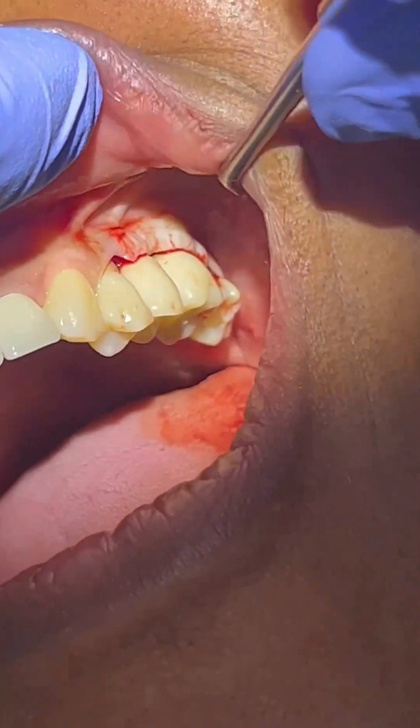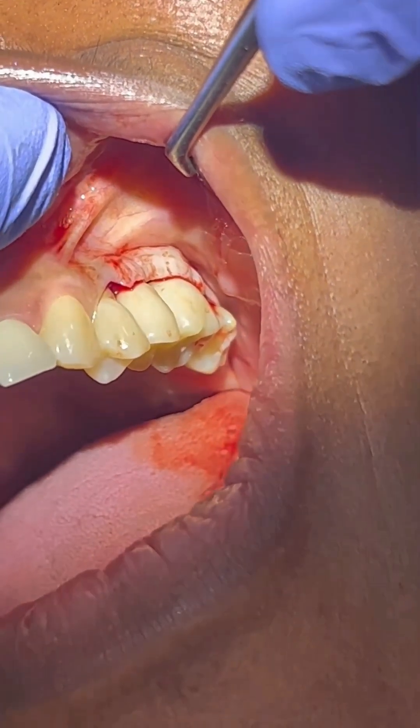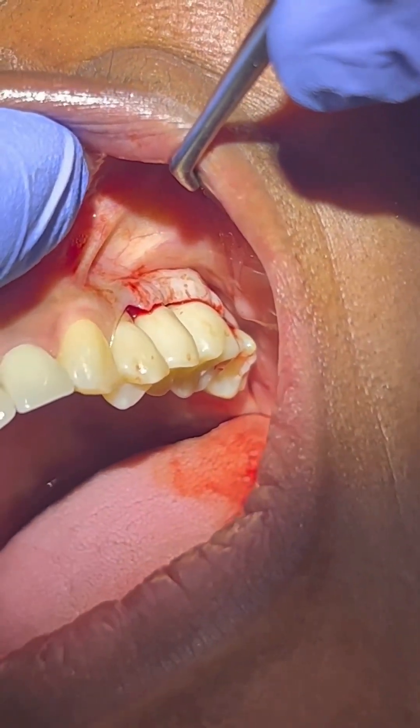Considering placing a suture here, but I'm pretty confident that we don't need a suture. This will heal nicely and maintain the keratinized tissue on the outside.